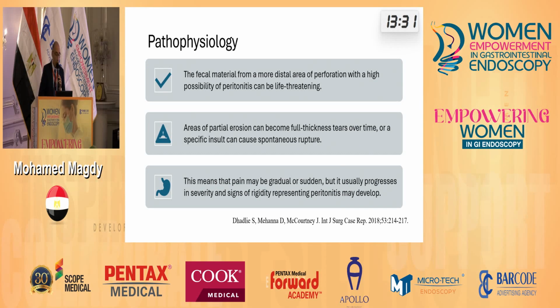Of course, anyone doing endoscopy, especially colonoscopy, knows that perforation is one of the known complications in diagnostic and also therapeutic procedures, especially with more advanced endoscopy procedures today, like EMR, that have advanced management for colonic lesions.